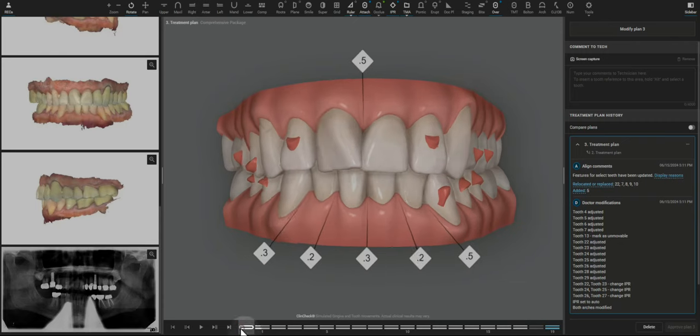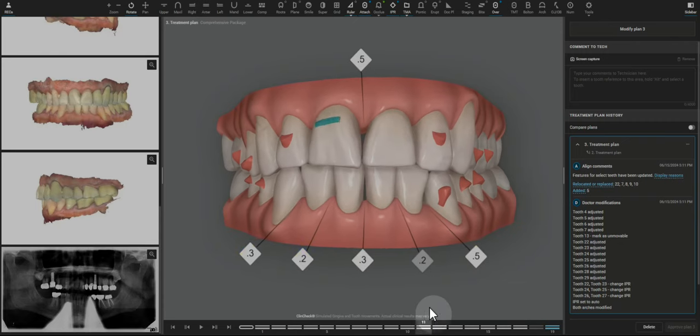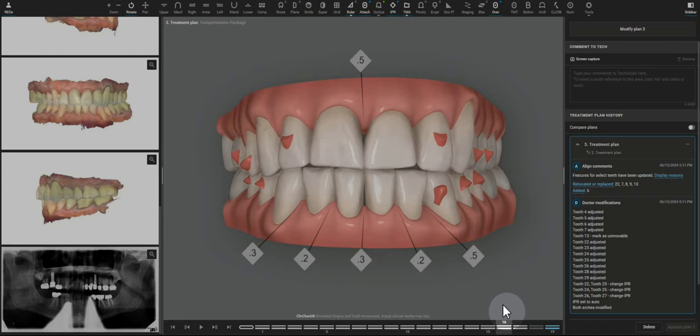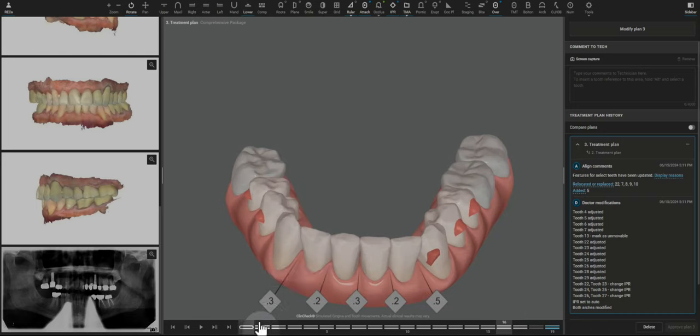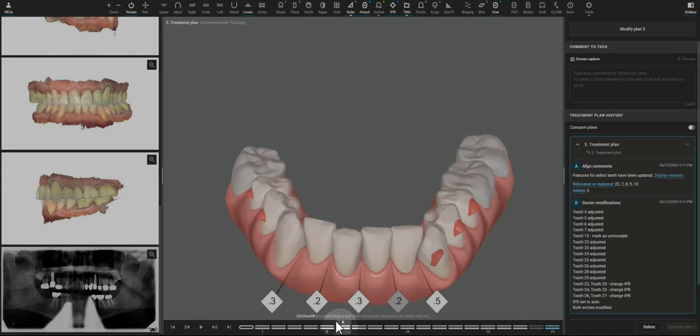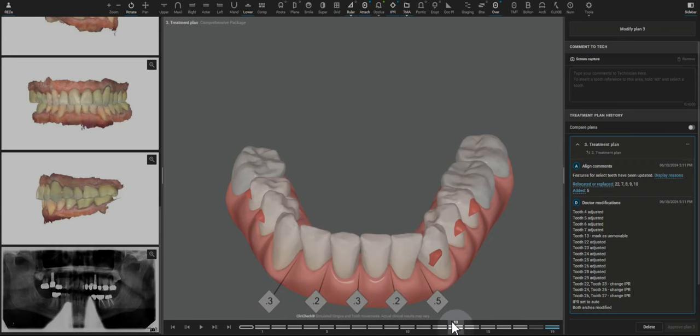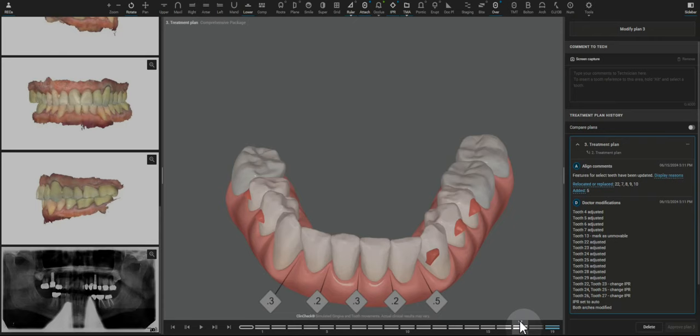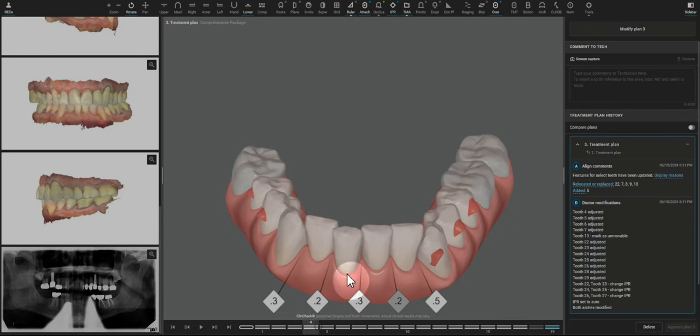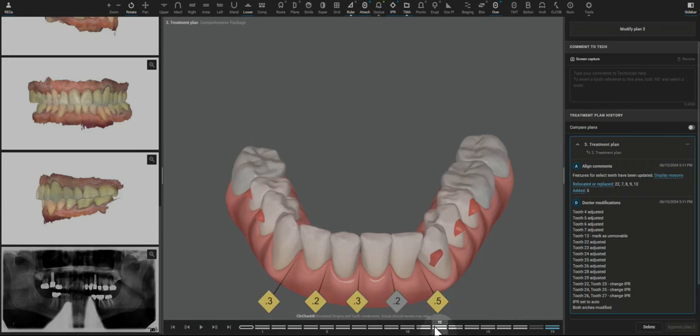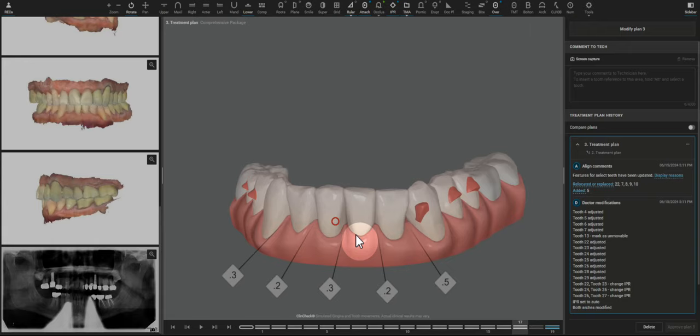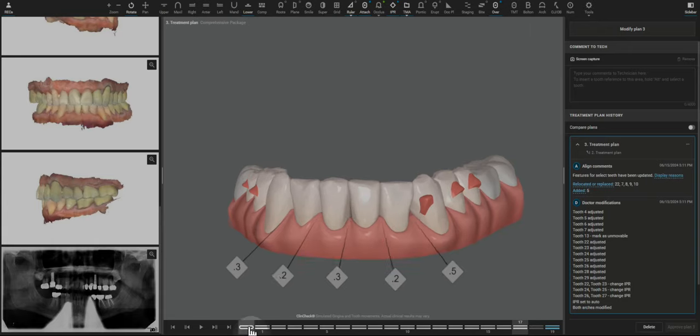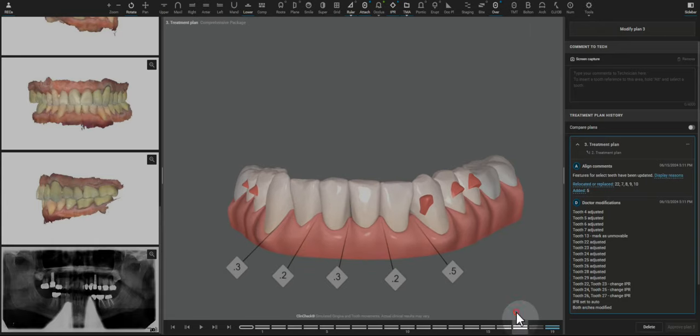Okay, here we have it and the IPR is being planned later. So I'm going to carefully look if there is round tripping that was planned in and I honestly don't think it is. I think the movements are just staged in a different way where this incisor comes buccal first and then the other incisors come to meet it. Round tripping would be if the teeth came out and then back in.